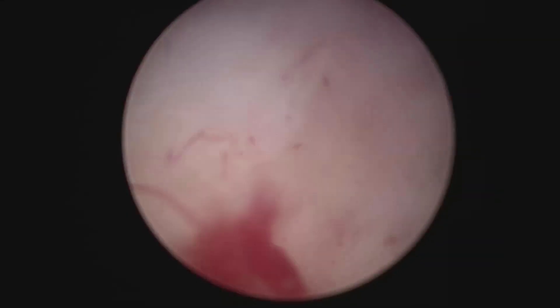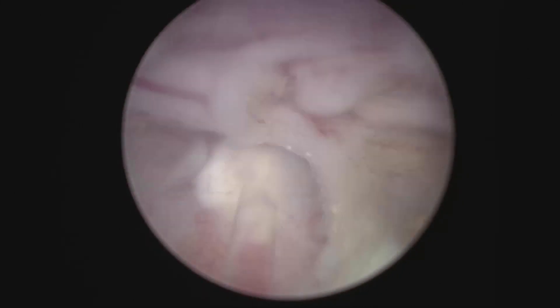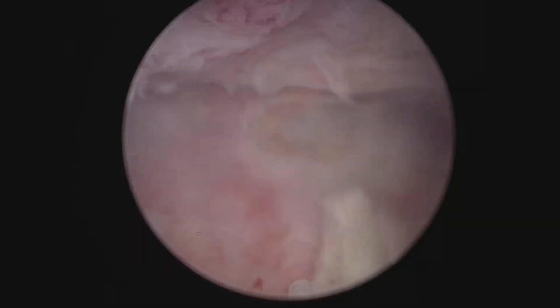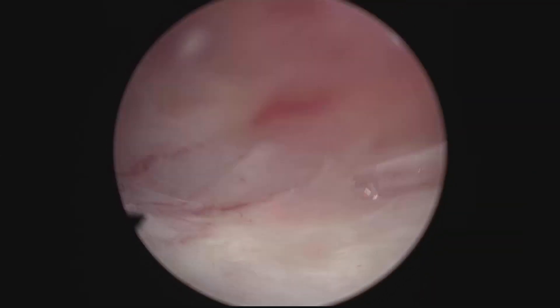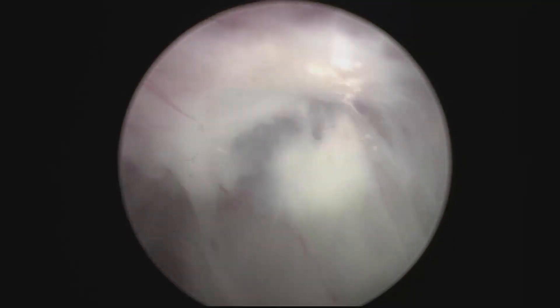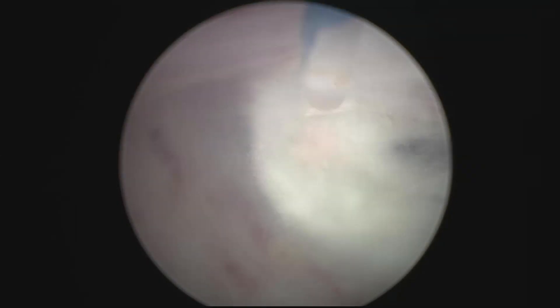Just with the tip of the scope — I have a special scope from Richard Wolf that allows for this mechanical dissection very, very gently. But this is more or less all of the mechanical dissection I will do. Here I'm just cutting on top of the verumontanum to join the planes on both sides. Then I will position the fiber at 12 o'clock. Here I'm checking that the liberation of these fibers at the edge is complete, because we don't want to break the sphincter's mucosa. Now for the remainder of the procedure, I'm going to keep my fiber at 12 o'clock and I will not rotate it. I think it's important to make this operation simple, and having to rotate the fiber usually confuses more than it helps, in my opinion.